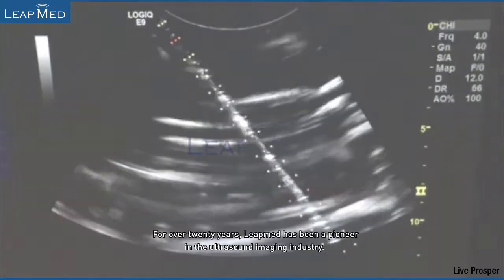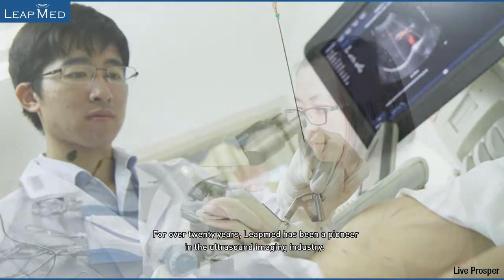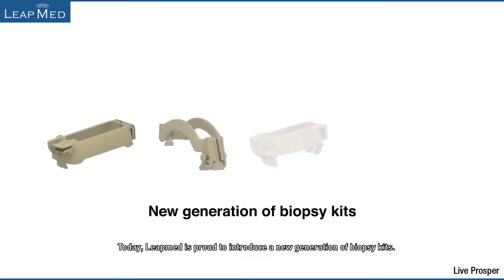For over 20 years, LeapMed has been a pioneer in the ultrasound imaging industry. Today, LeapMed is proud to introduce a new generation of biopsy kits.